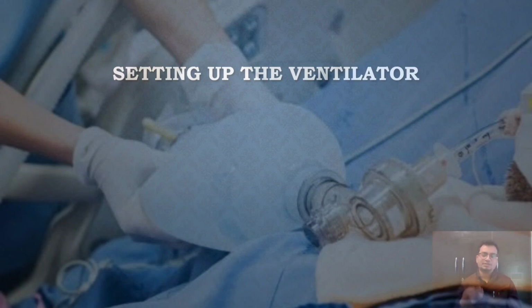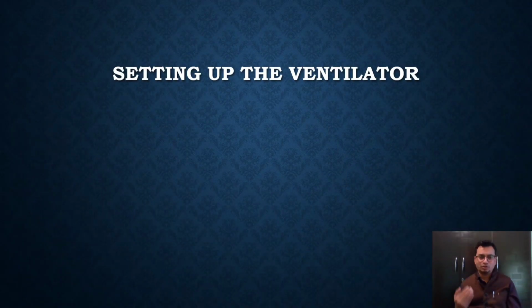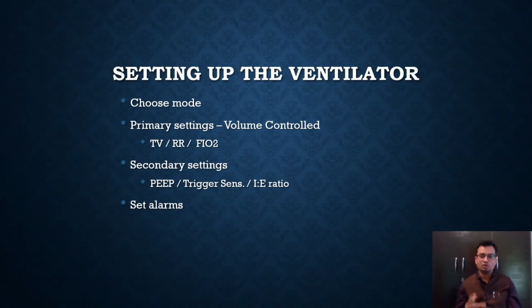So right after intubating the trachea, you do a mechanical ventilation with the ambu bag, then you connect with the actual ventilator, right, the automatic ventilator. That will be the better thing, but you can adopt any other fashion or any other protocol if you have one in your institution. Now this is the time to check the pending chest radiography and ABG and set the ventilator accordingly. Mode is usually volume control, assist control mode.